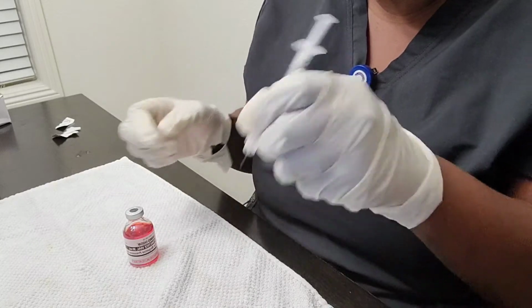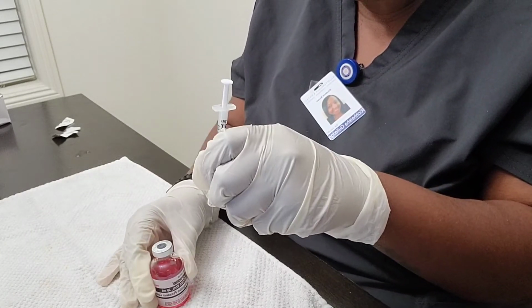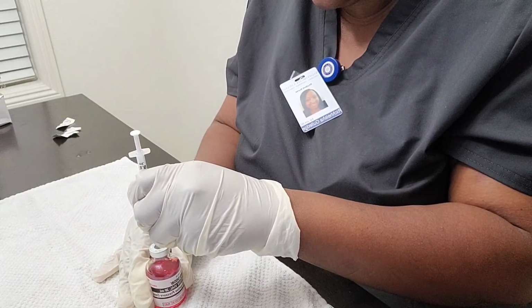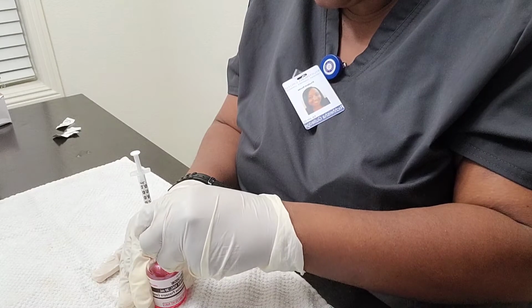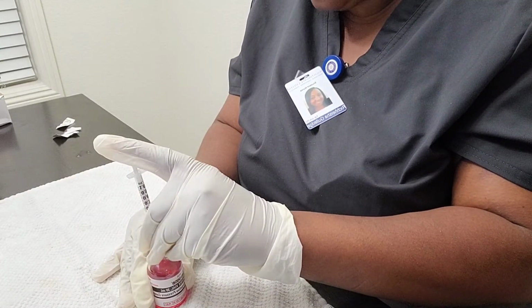Then I will hold the syringe with my dominant hand and hold the vial with my non-dominant hand, and then stick it in. And then I will let out the air.